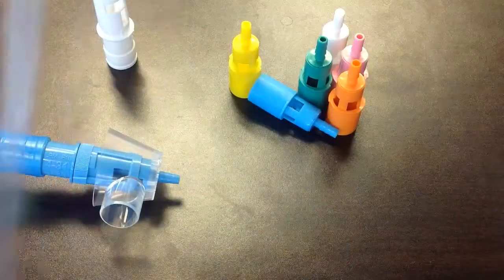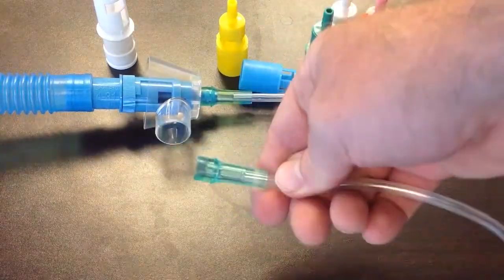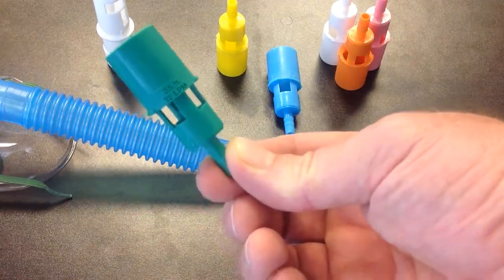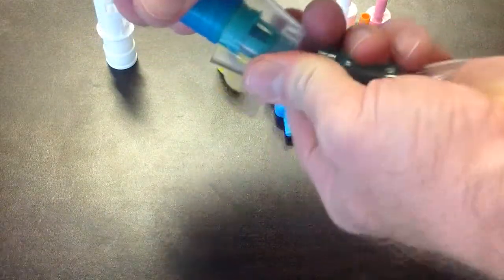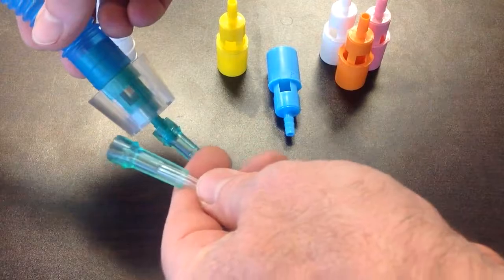And then here, you take your oxygen tubing, hook it to this end, and the other end would get hooked to your flow meter. Okay. With the other ports, if you want to set up a, let's do the green, because it's easier to read, 35% Venturi Mask. This will go in here. This will go in here. Those go together, and then this end will get hooked to the flow meter at 12 liters per minute. That is your Venturi Mask.